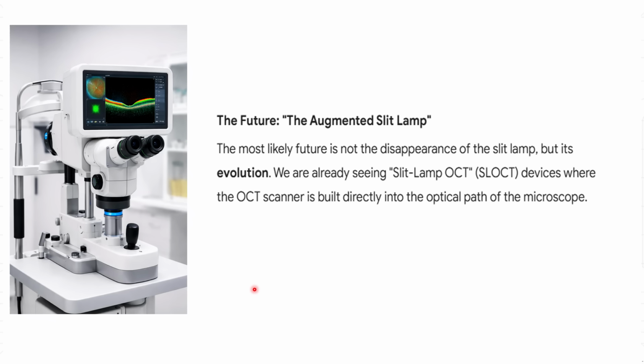Now the question that arises: does this mean that we are going to forget the slit lamp and keep it in the museum? The answer is no. There are certain advantages of the slit lamp. One of them is true visualization, that you are dealing with a true visualization.